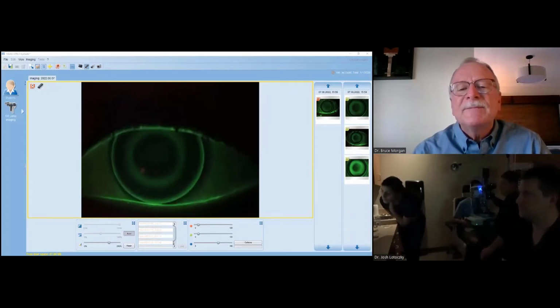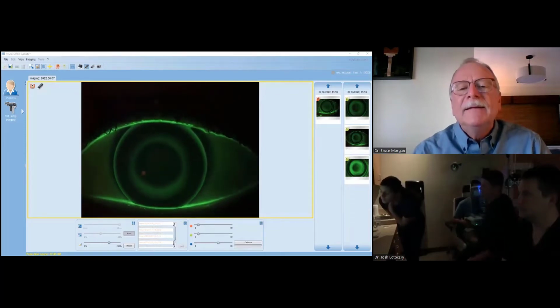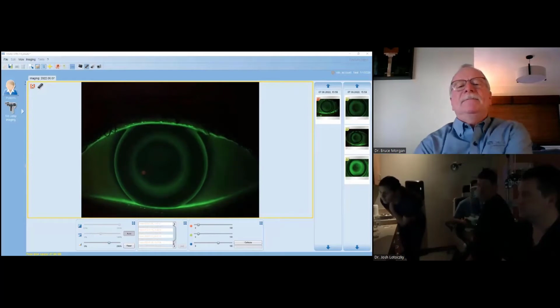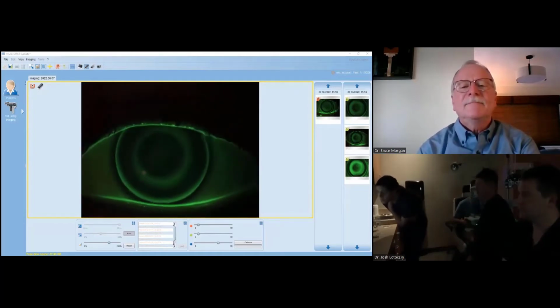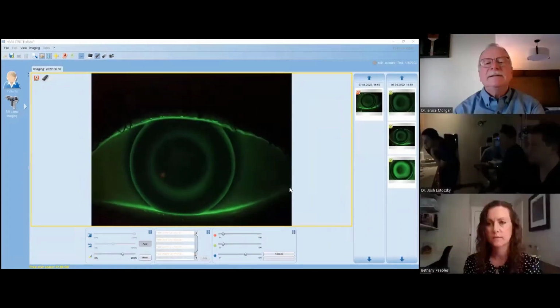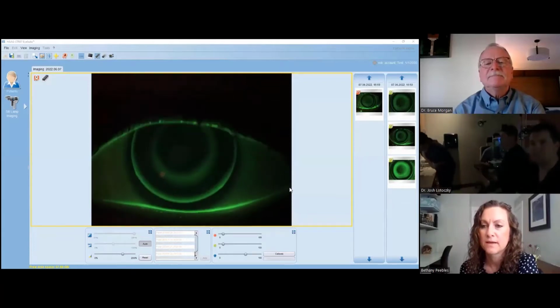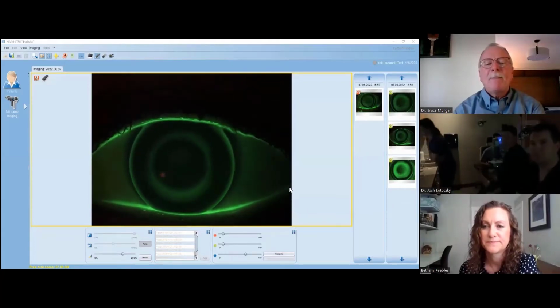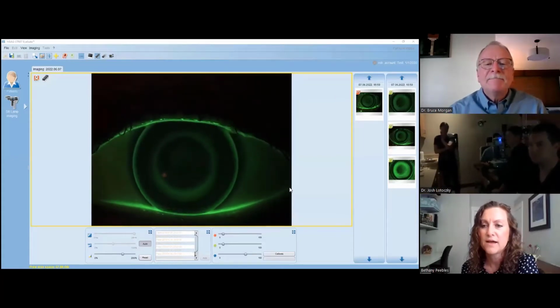And if we were going to see if you get more in there, you can see it widening a bit. Part of it is, the camera only picks up so much through the slit itself. With my eyes, it looks pretty good. It looks more like this, if not even a little bit more. Yeah, I think that's a little bit of artifact from the camera. The dimple veiling doesn't worry me at all. I just wanted to point it out in case anybody saw it and was wondering what that was. Right. Very common.